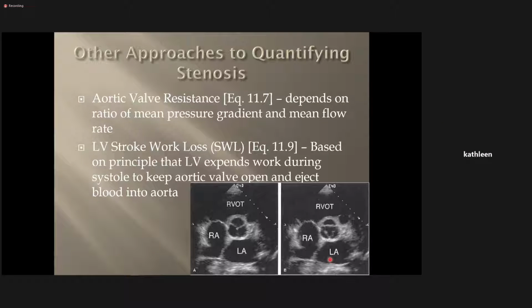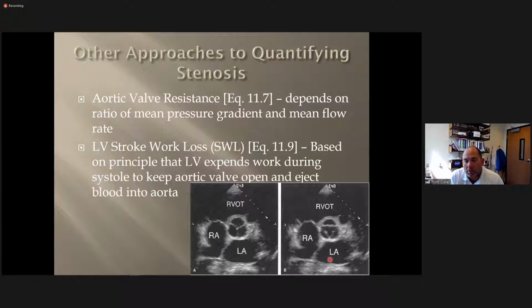Okay, so go ahead, Stephanie. Is the machine calculating the continuity equation, or are we taking our information and doing that ourselves? If you plug it into the calculation package, which you should always do, the machine will calculate for you. At the end of your study, you should go through and pull up the report pages, because that's where you're going to find the calculated values. I always recommend taking pictures of your report pages when you're finished.